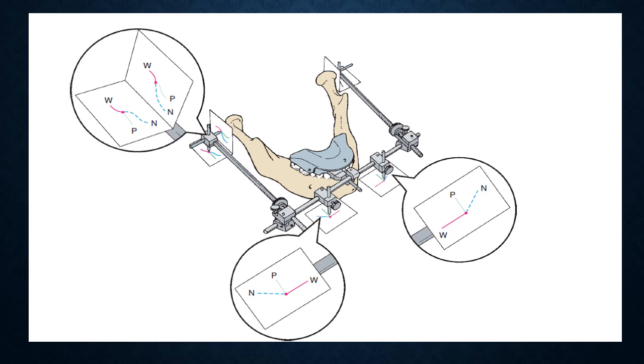This is simply what you will get after doing the pantograph tracing. It will trace the mandible. As you can see, the double tracings are the working and the non-working, and for protrusion near the condylar side, and in the anterior region you have two stylus. It will trace the mandible into protrusion, retruded, working, and the non-working side.